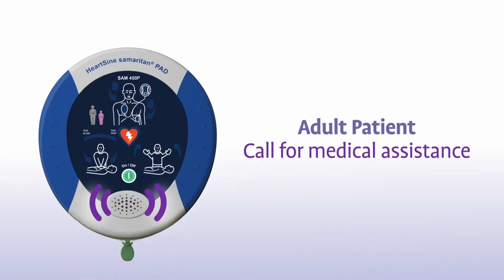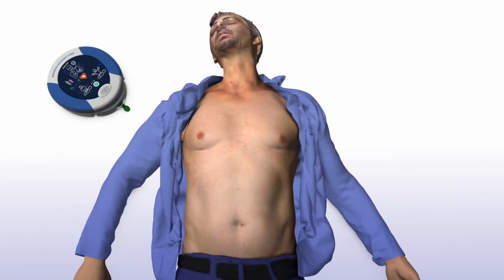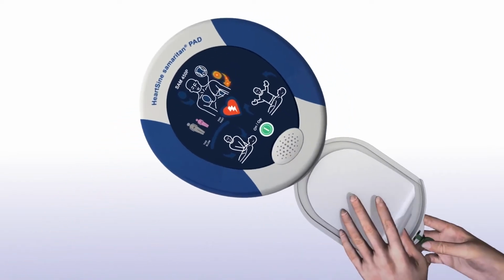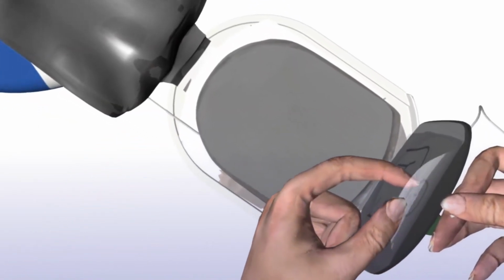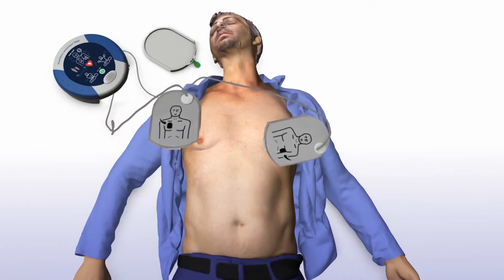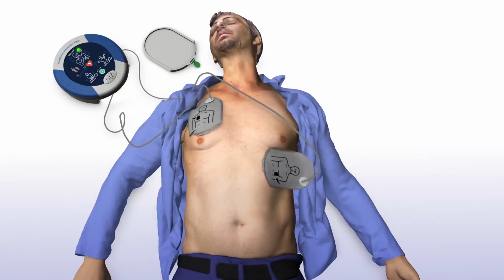Adult patient. Call for medical assistance. Remove clothing from patient's chest to expose bare skin. Pull green tab to remove pads. Peel pads from liner. Apply pads to patient's bare chest, as shown in picture. Press pads firmly to patient's bare skin.